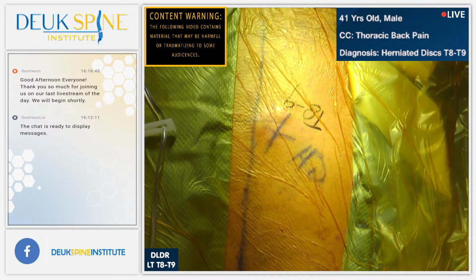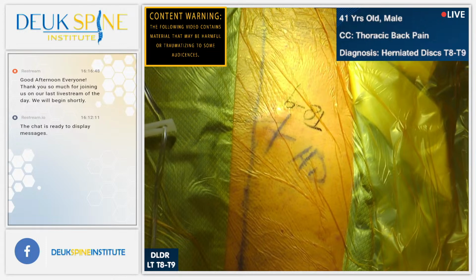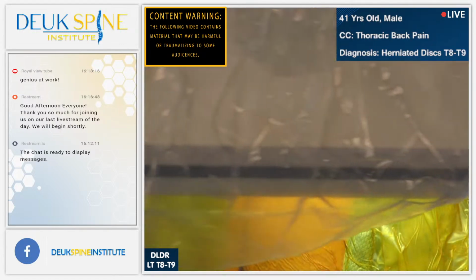Let's bring the fluoro in. So welcome to our live stream. Feel free to ask some questions. I'll do my best to answer them for you. We're only fixing one disc. It'll be from the left side.